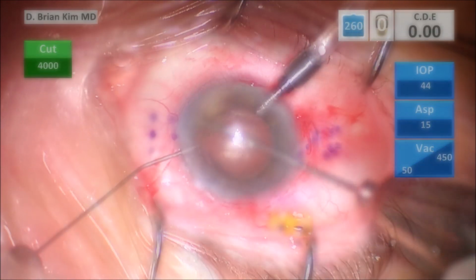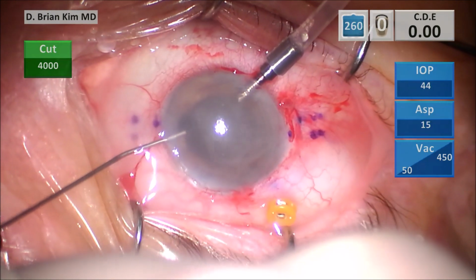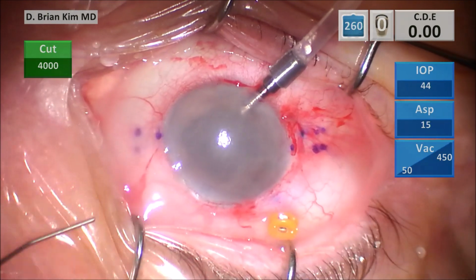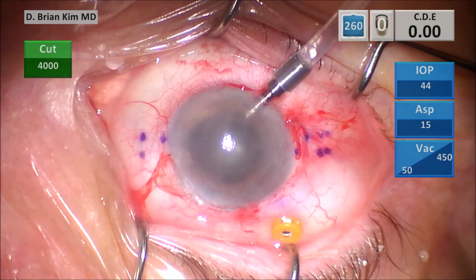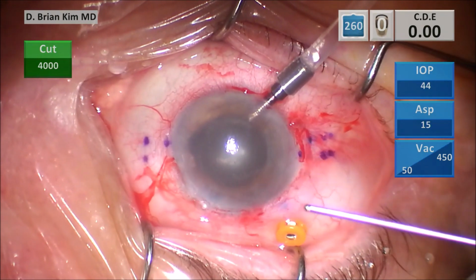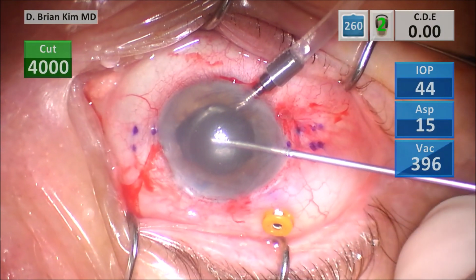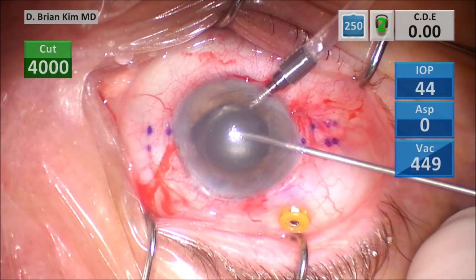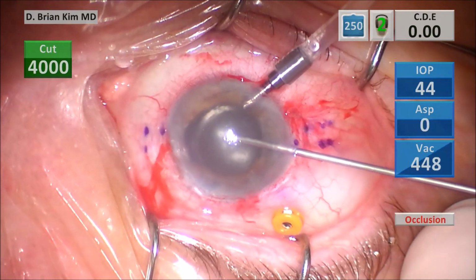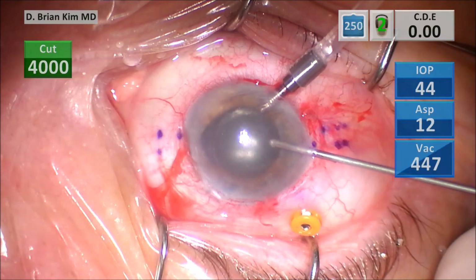This is first some intracameral triamcinolone, just to ensure again that there's no vitreous in the anterior chamber. And thankfully there is not any vitreous in the anterior chamber. Go ahead and remove that Kenalog in the anterior chamber with the vitrector again. And it doesn't hurt to have a little bit of triamcinolone at the end of the case, especially since this patient has cystoid macular edema.